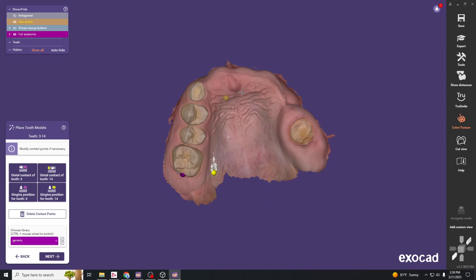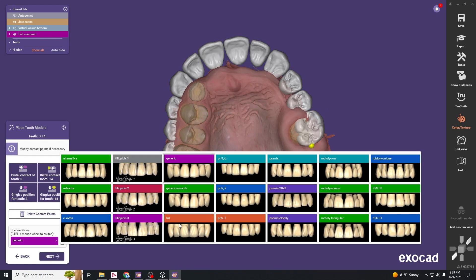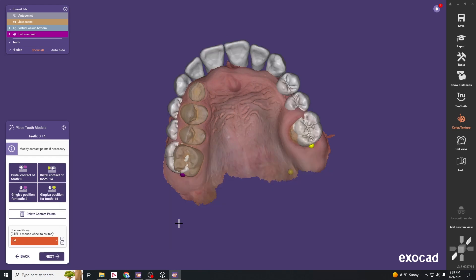We want to hit the distal contact of tooth 3 and then the distal contact of tooth 14, and that'll set our teeth here. You can change to whatever tooth form you want in the library.